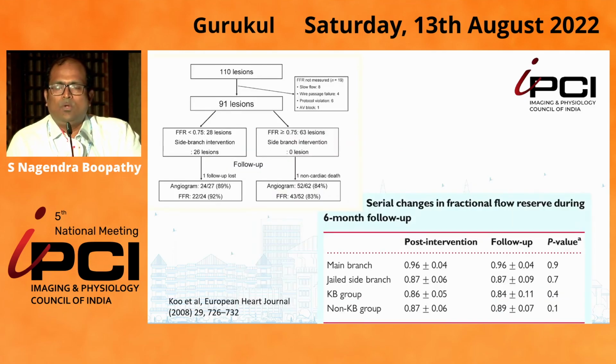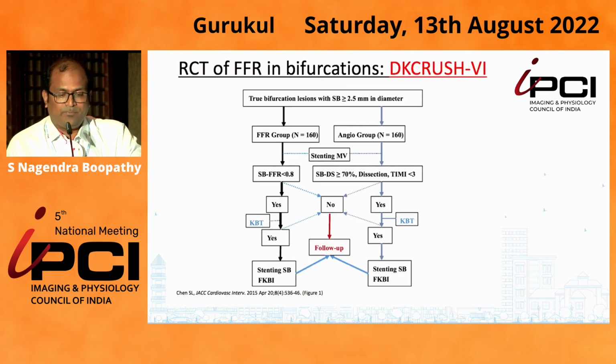However, they did one important assessment. They also did a follow-up FFR after 6 months in those patients who had an initial post-procedure FFR. And they found that the FFR which was left at the index procedure remained the same even at 6 months. That's an important point to remember. So FFR did not worsen in such patients in whom a side branch FFR was done and was found to be not significant, or side branch FFR was done and was found to be significant, and they did a POBA alone for the side branch opening followed by FKBI. That is a very reassuring point for our clinical practice.